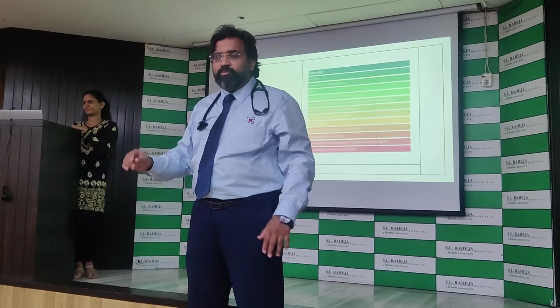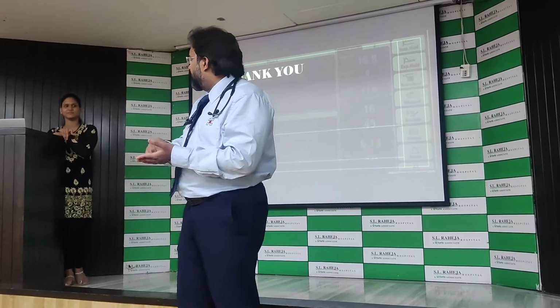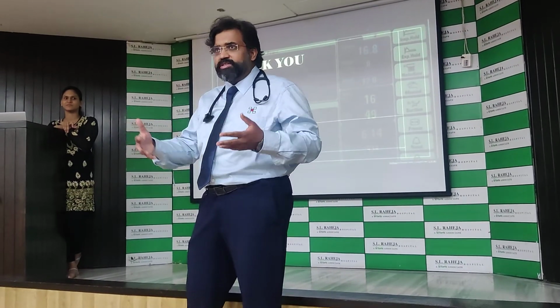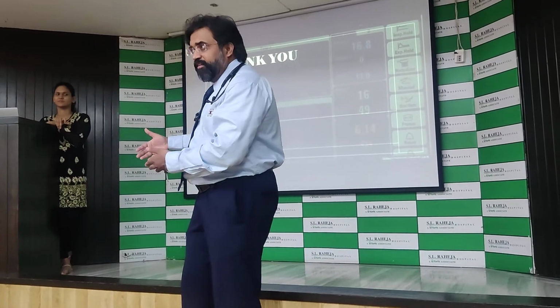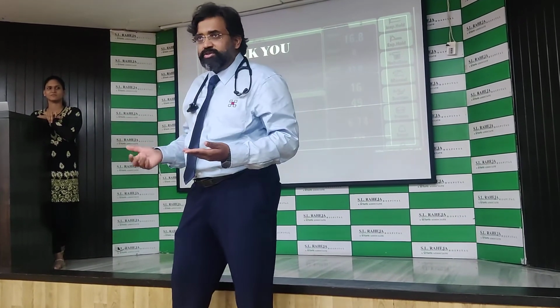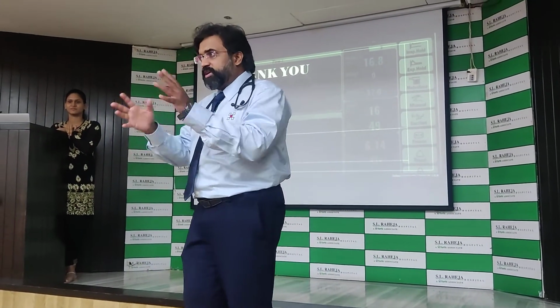It's so simple. Whenever we calculate the transpulmonary pressure, what are we doing? We're calculating the P inspiration minus PEEP. We're doing the calculation, finding the transpulmonary pressure, seeing what is happening, and then going ahead, right? In this, you don't need to do all those calculations. You just increase the PEEP and you'll see it coincide. So at the end of the day, it becomes a complete ventilator.